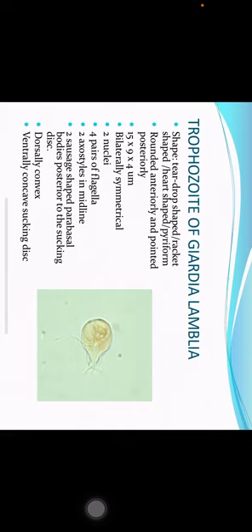Trophozoites of Giardia lamblia: tear-drop in shape, also described as racket-shaped, heart-shaped, or pyriform. They are rounded anteriorly and pointed posteriorly. Dimensions are 15 by 9 by 4 micrometers. They are bilaterally symmetrical, have two nuclei, four pairs of flagella, two axostyles in the midline, and two sausage-shaped parabasal bodies posterior to the sucking disc. They are dorsally convex and ventrally concave at the sucking disc.